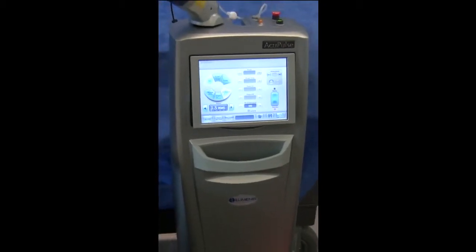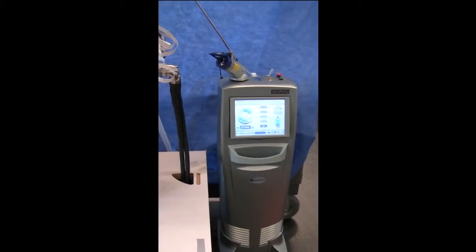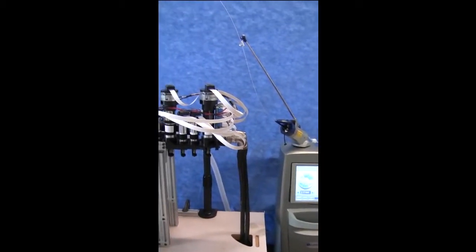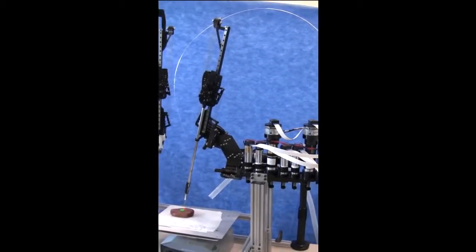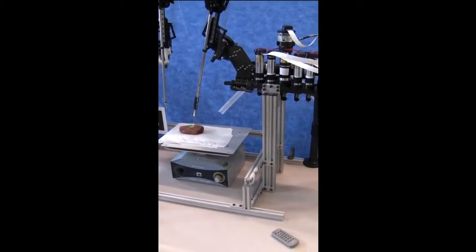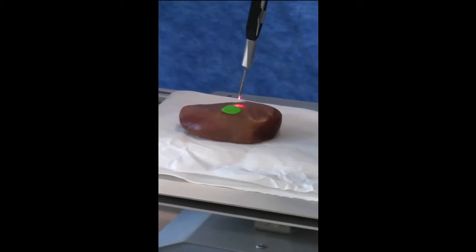Here we see a surgical laser which is used for various procedures. The laser light is carried through a fiber and delivered to the target. We have taken the fiber and attached it to the Raven robot arm so that the Raven controls the laser position. This allows the surgeon to take advantage of our virtual fixture and haptic rendering technology for more precise positioning.